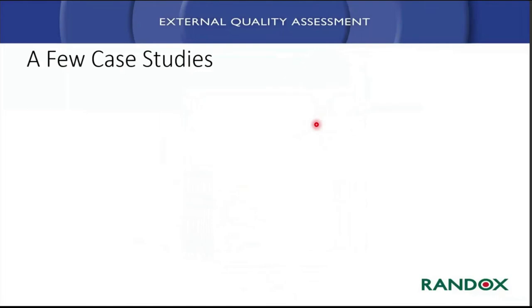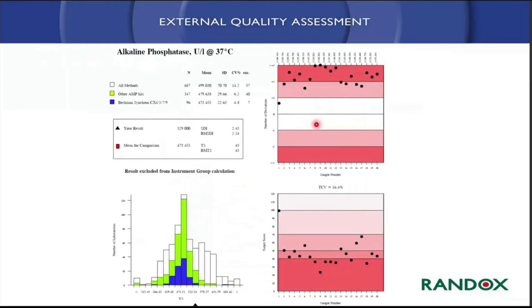So, a few case studies, as I said, about why run EQA. Now for those of you who are not familiar with EQA reports, or even for ourselves, our own RIQAS reports, most reports that you'll get from EQA will have certain similarities. You'll tend to have stats, you'll tend to have a histogram, and the likes of a Levey-Jennings chart that you will see similar to your internal QC.